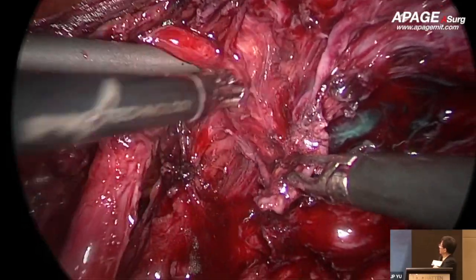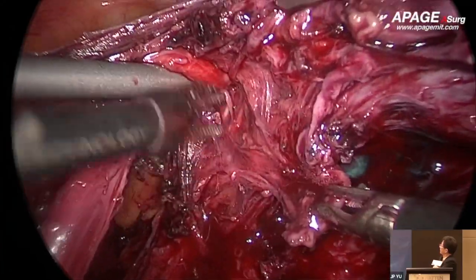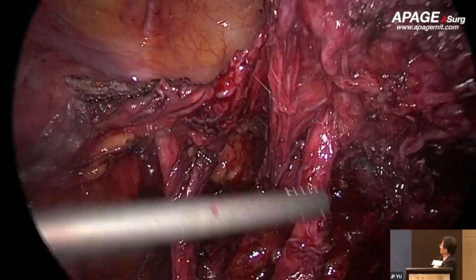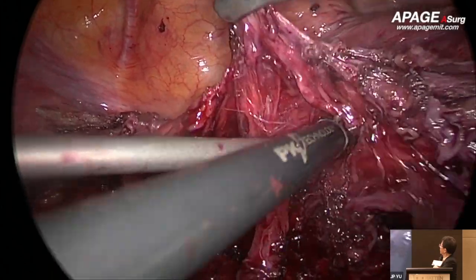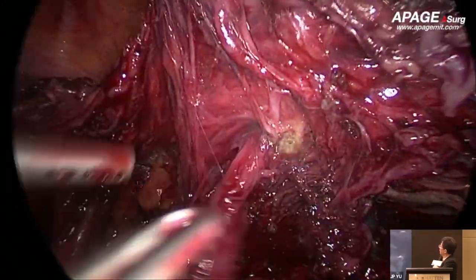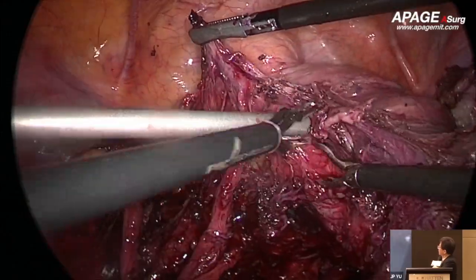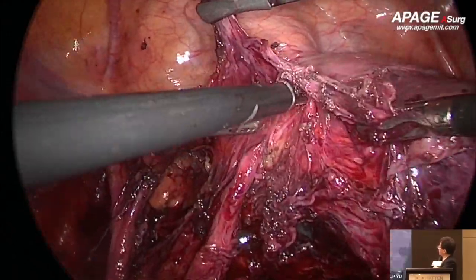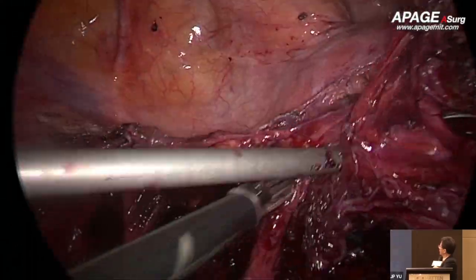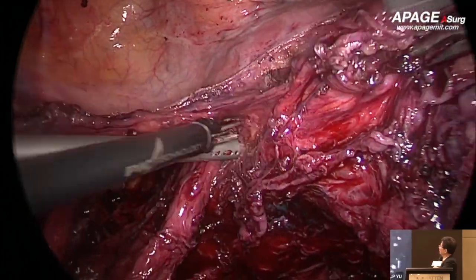And so here is the uterine artery dissected out. Okay, again, we dissect it again. Okay, so all the way the ureter to the bladder has been identified and released. And here is the so-called medial parametrium. Because of the preservation, we just take a little bit. Here is the so-called vesicouterine ligament here. Okay, we dissect it up. And so the ureter has been identified and pushed down here.